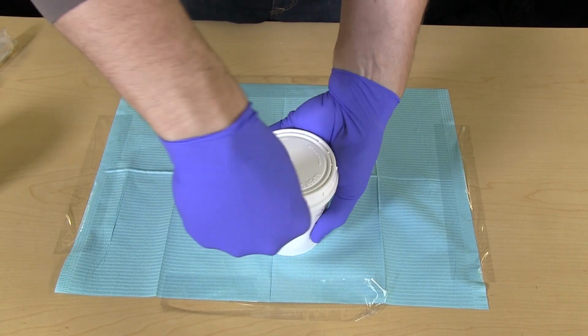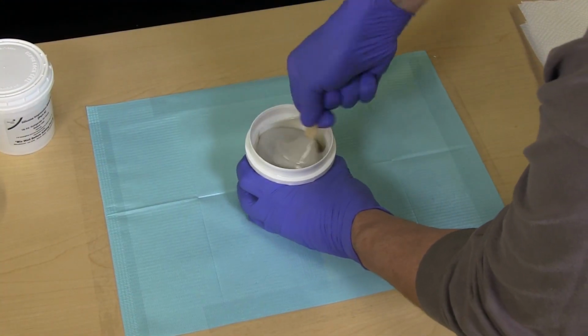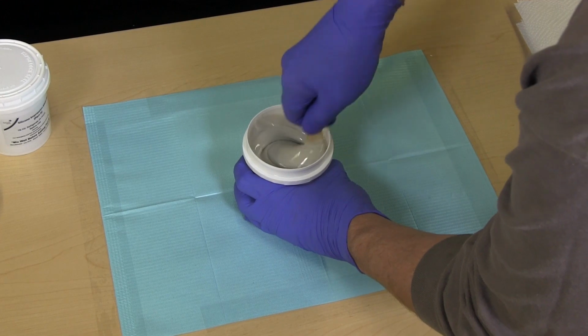Open the impression containers and pre-mix unactivated material. Settling can occur during shipping and may affect the curing process.